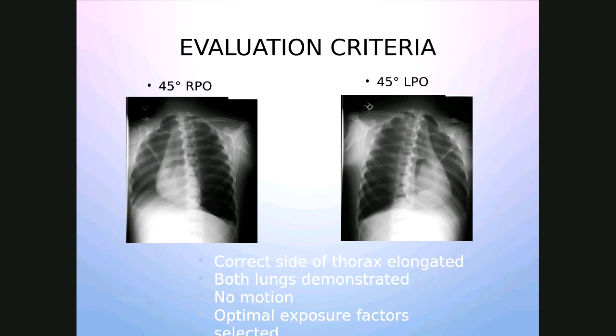They're called nipple markers, and I will show you a picture of those. It's basically like a little BB on a piece of tape. Sometimes if we can feel a mass or a nodule, or we know that's what the radiologist is looking at, we'll put that BB on there so that it shows radiographically, because it is made of metal, and we can correlate on the skin where that is in the body. So sometimes we do use those little markers to show where it correlates to in the body.